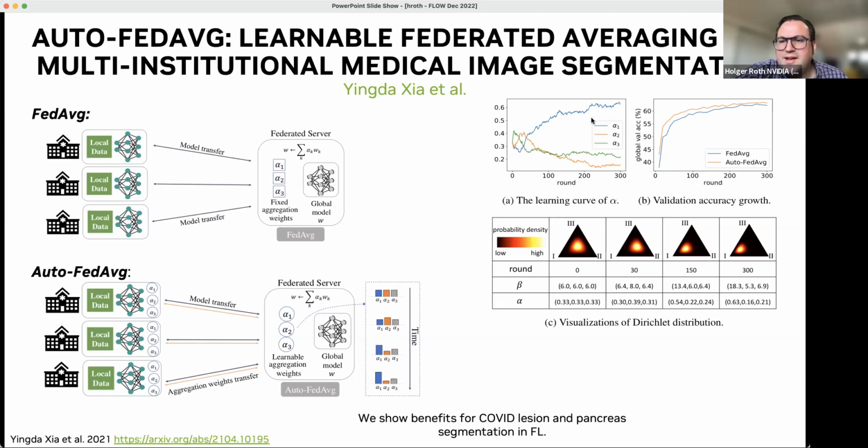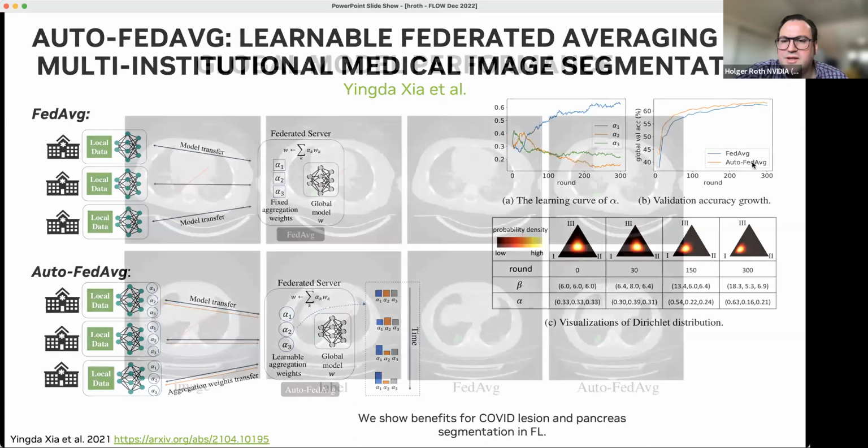So it turns out that the relative weights are very similar to what a FedAvg approach would also give you, based on the data size. But that also indicates that the algorithm is working correctly. And in some cases, you might see a larger improvement compared to federated averaging. Here we still get a reasonable boost in performance, I think, by doing this data-driven approach for learning the aggregation weights.